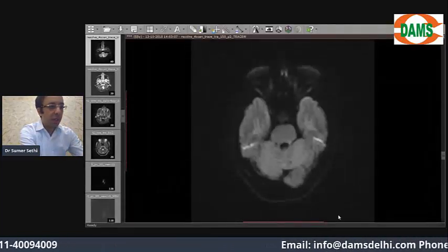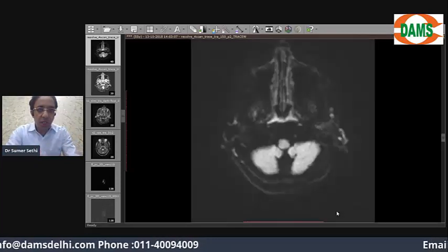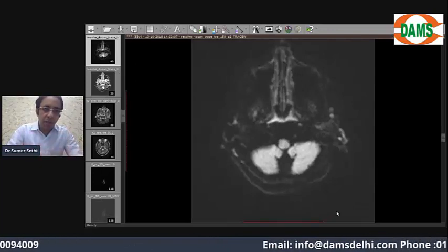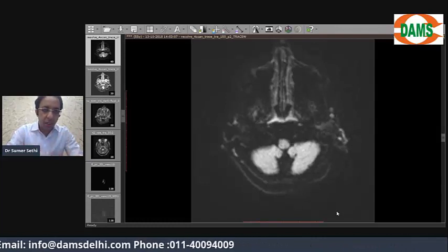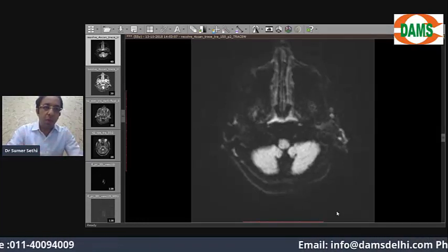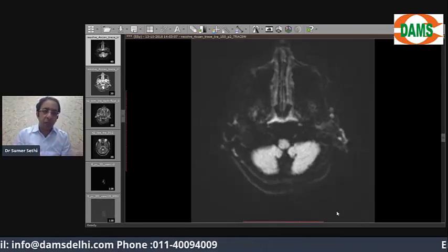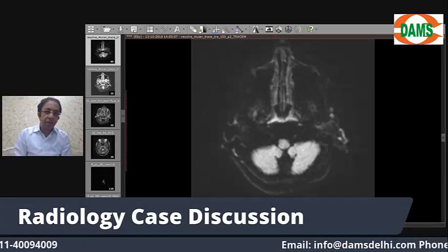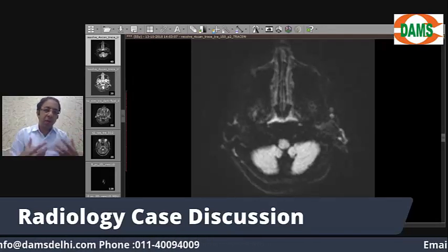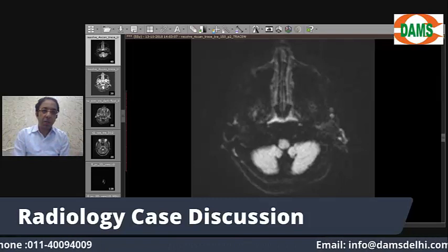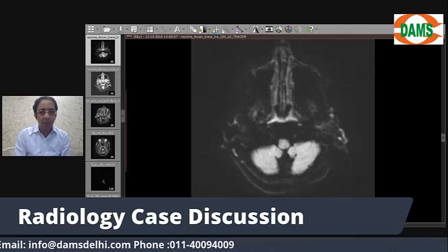Now in front of you is the diffusion-weighted MRI of the patient. Diffusion-weighted MRI is a specialized technique based on particle motion — any area where there is no particle motion will appear hyperintense. In an acute infarct, because of hypoxia and lack of ATP, the sodium-potassium ATPase is not working and there is no movement of particles, hence the infarcted area appears hyperintense.